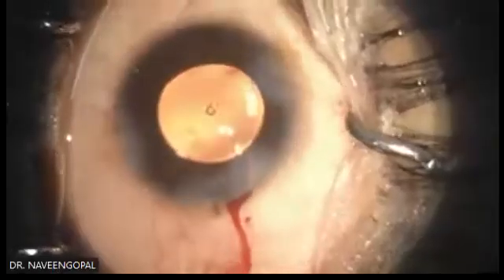We don't prefer it. Since there is a central hole, you don't have to really use intracameral pilocarpine.